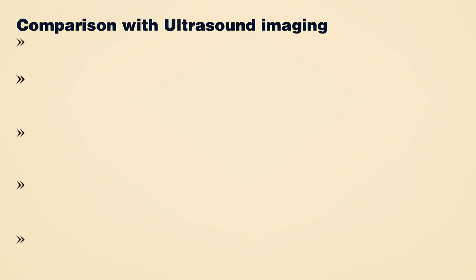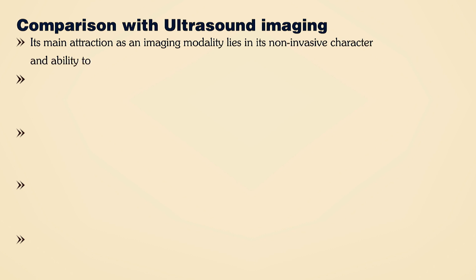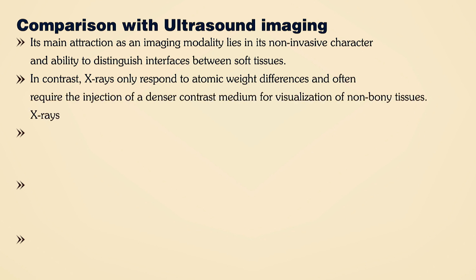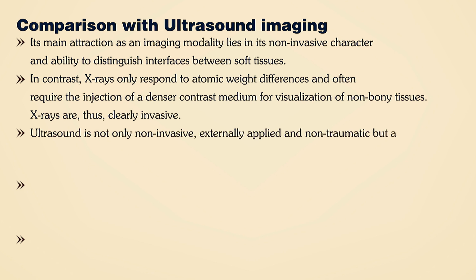Now, I am going to compare CT with ultrasound imaging. Ultrasound's main attraction as an imaging modality lies in its non-invasive character and ability to distinguish interfaces between soft tissues.